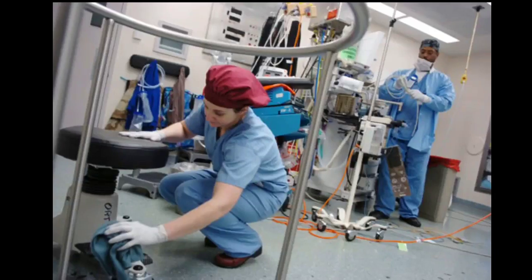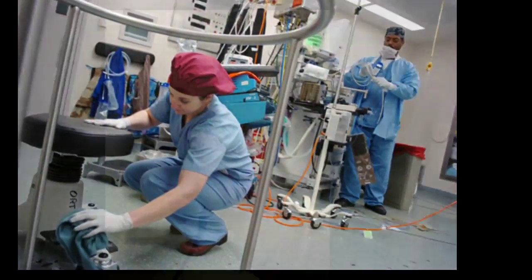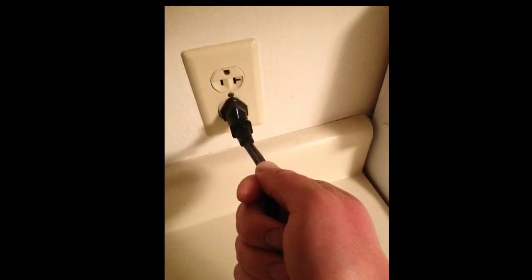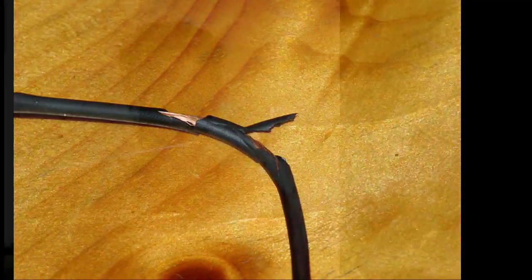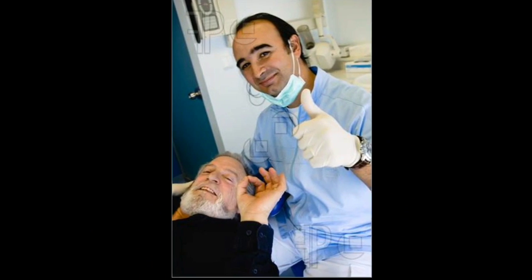Finally, after surgery is complete, to ensure that your electronic medical devices will be in working order for the next surgery, make sure that you disassemble them correctly and unplug them by the plug and not by pulling on the wire, as it will lose its integrity and expose live wires. If we can follow these measures before, during, and after surgery while using electricity, we can prevent any and all injury to the patient.